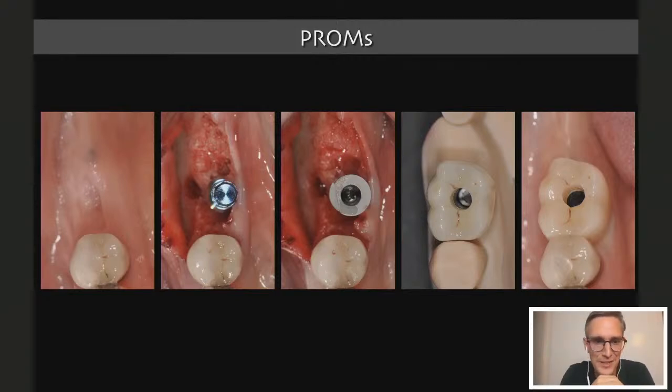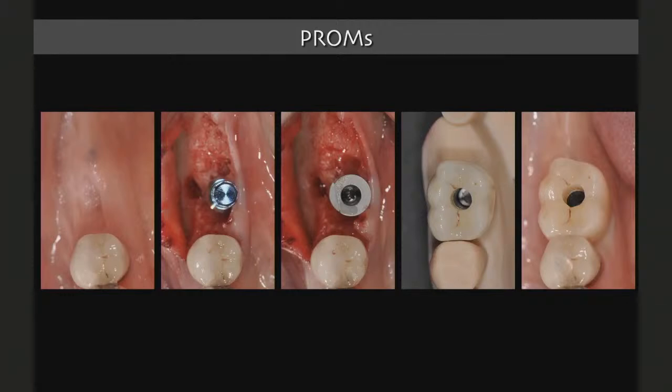Your final crown will not be able to be delivered to the implant. So what would be your advice in that case then? Would you always use a titanium or metal scan body, or what should we do?